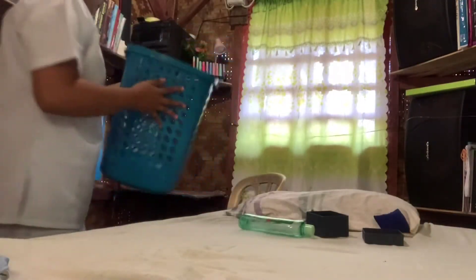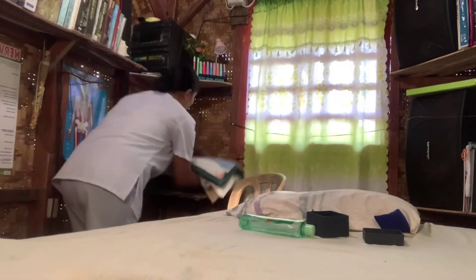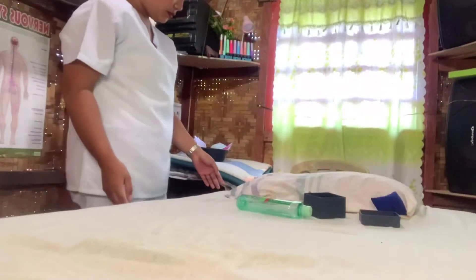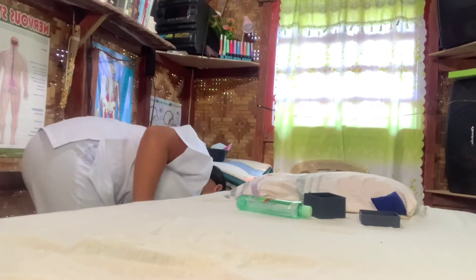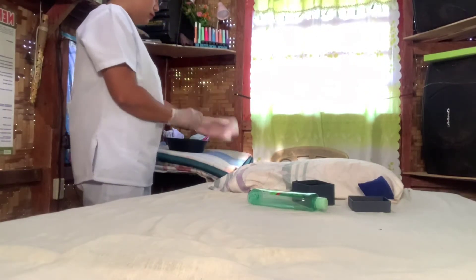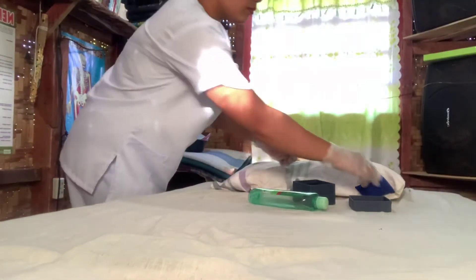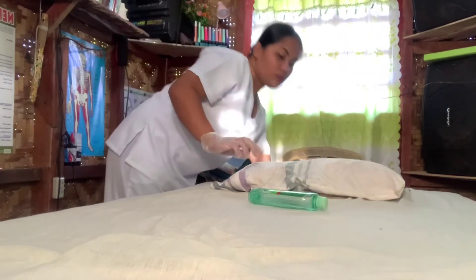Obtain a laundry bag or an improvised hamper, gather the linen to be used, and place it in order. Obtain the materials for cleaning the mattress. Raise the bed to an appropriate working height to prevent fatigue, and be certain that the wheels are locked to keep the bed from moving. Put on gloves before handling linen soiled with body secretions.